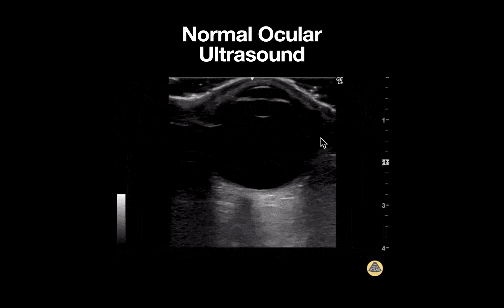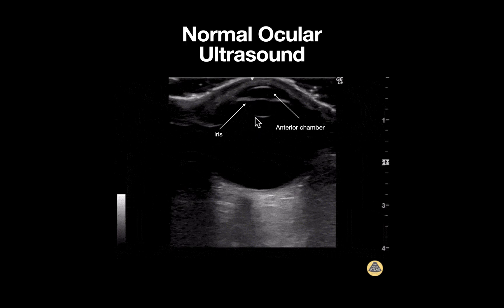Let's look at some important anatomy from superficial to deep. At the top of the screen we can identify an anechoic anterior chamber. Just deep to this is our iris, which appears hyperechoic. A few millimeters below this is our lens, and just below it, this anechoic area is our vitreous.